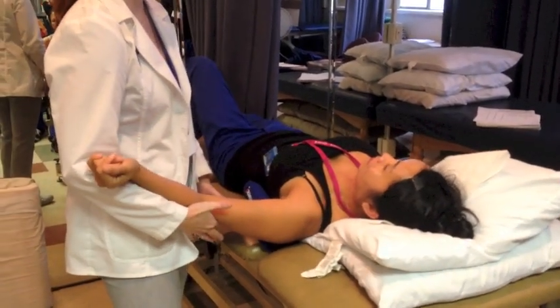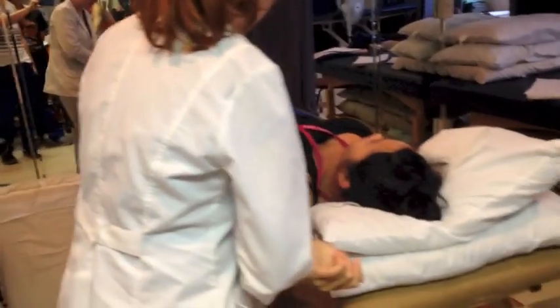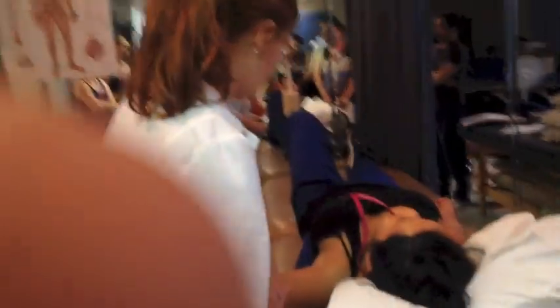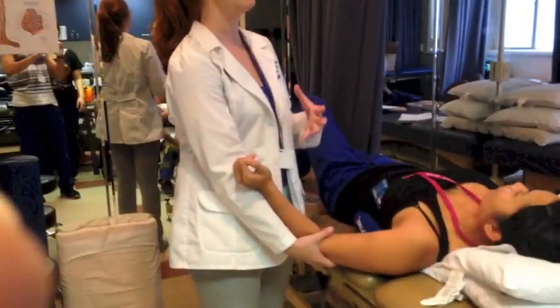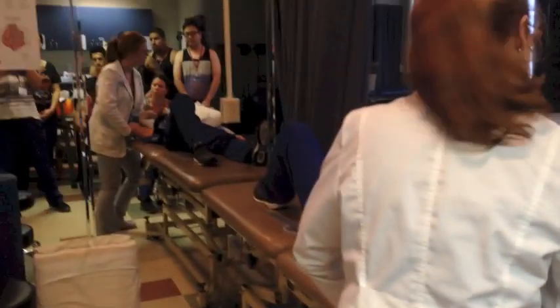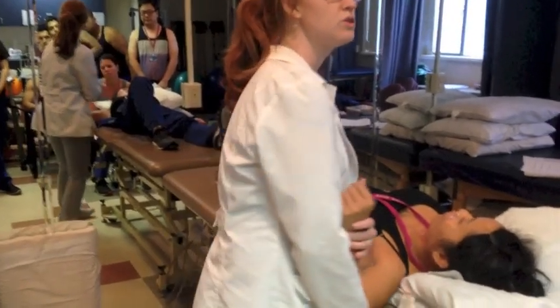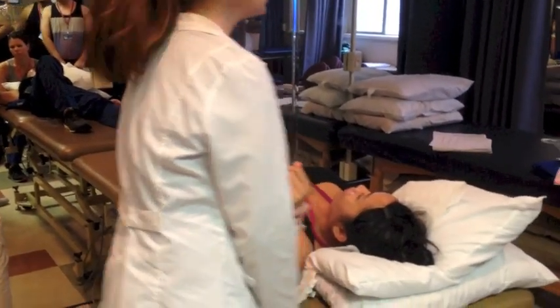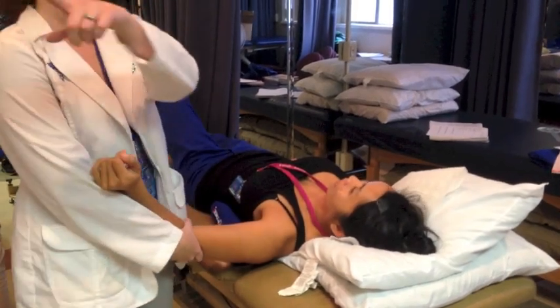I'm still supporting the humerus, bringing her up, keeping her in the same plane. She starts to have resistance. I want you to stop as soon as you start to feel a little bit of resistance. I could push her a little bit more, but we're getting a little more scapular motion. As soon as you start to feel resistance, that's when you stop. Some of you may not feel resistance — like Tina and Lauren probably don't.